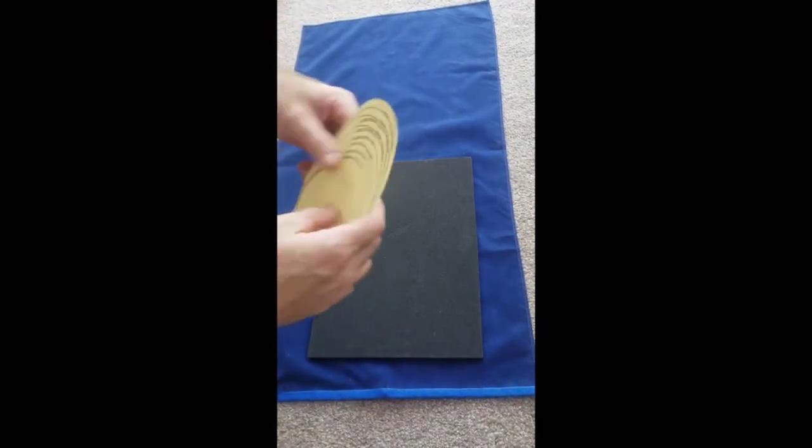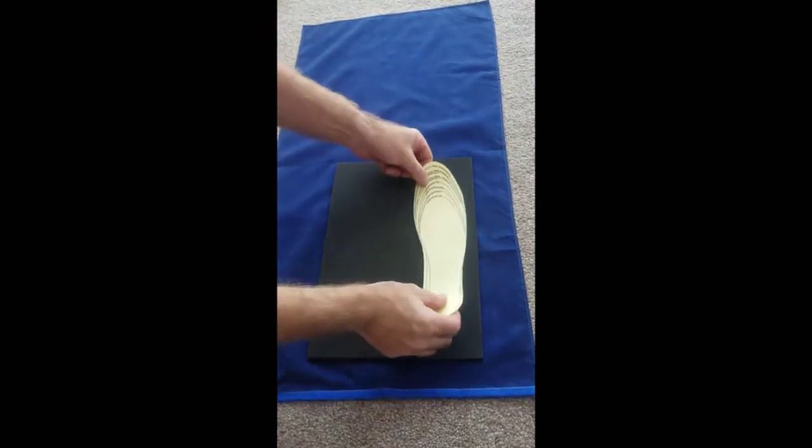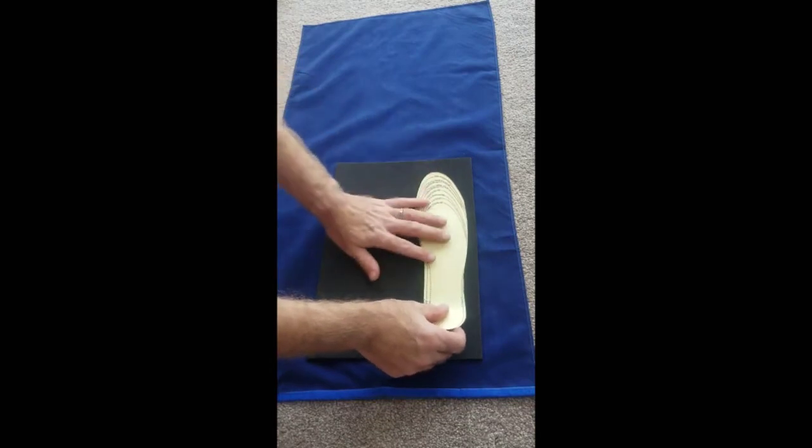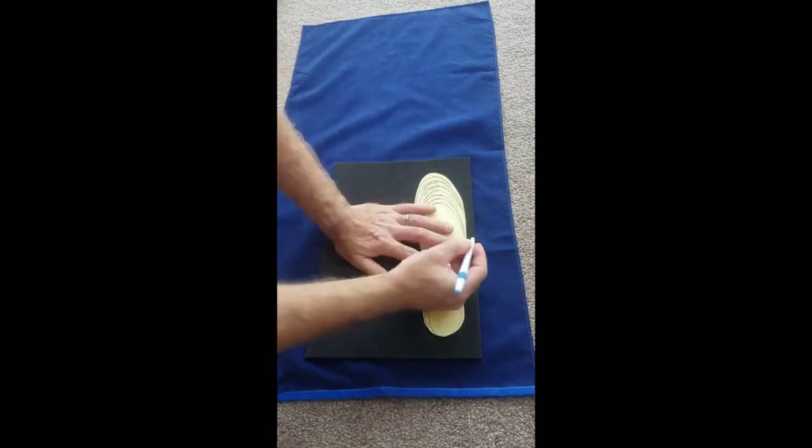There we have it. I've cut out the men's size 10 line and I'd place it on the Plastazote sheet.